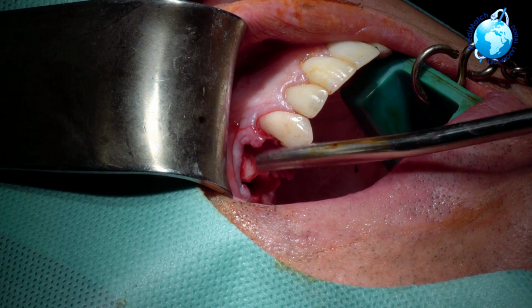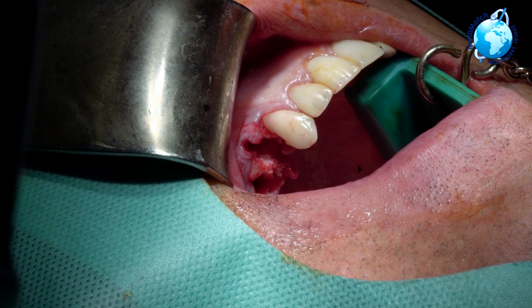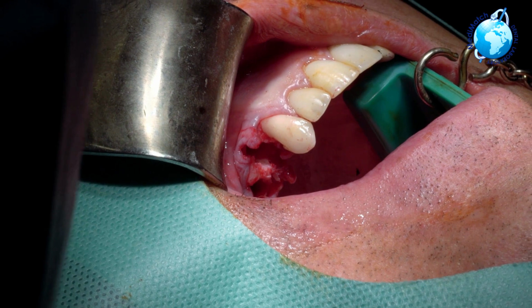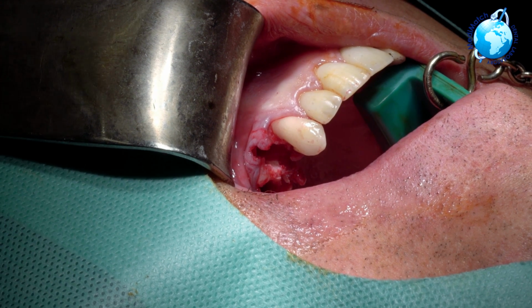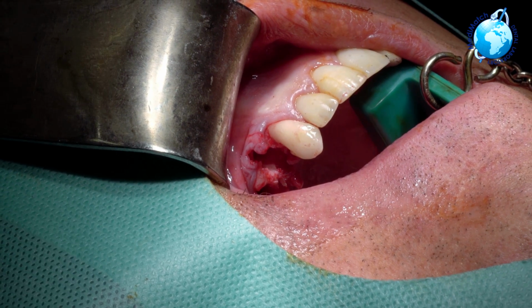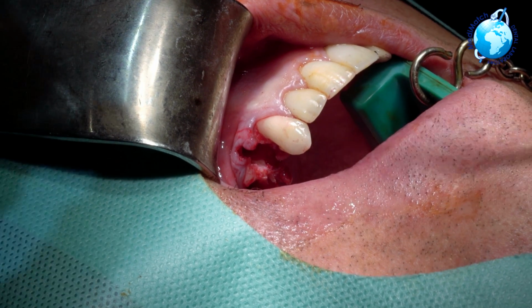So most with immediate placements, you need minimal drilling. Okay, that's fine. 3.5 by 15 millimeter implant. Alan, how you doing? Yeah. All right, Alan's good. I'm good. Bianca, how you doing? I'm good. Well, everyone's good.